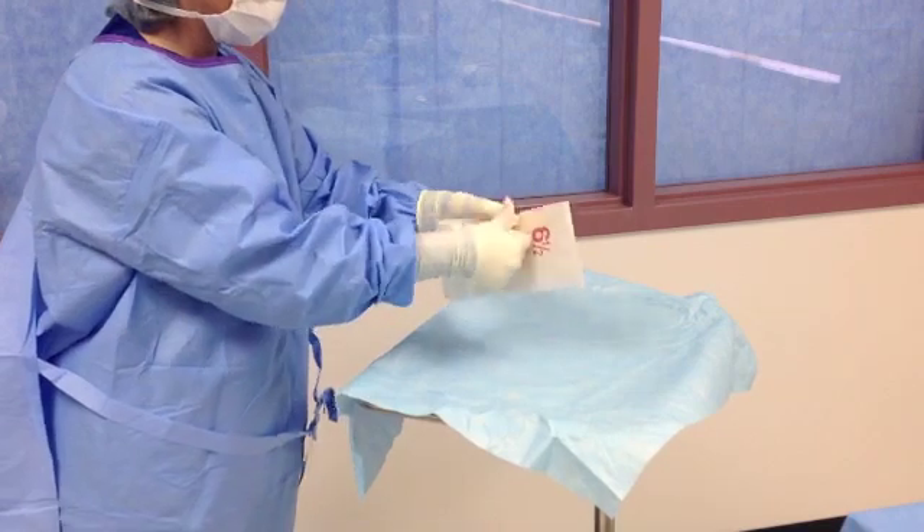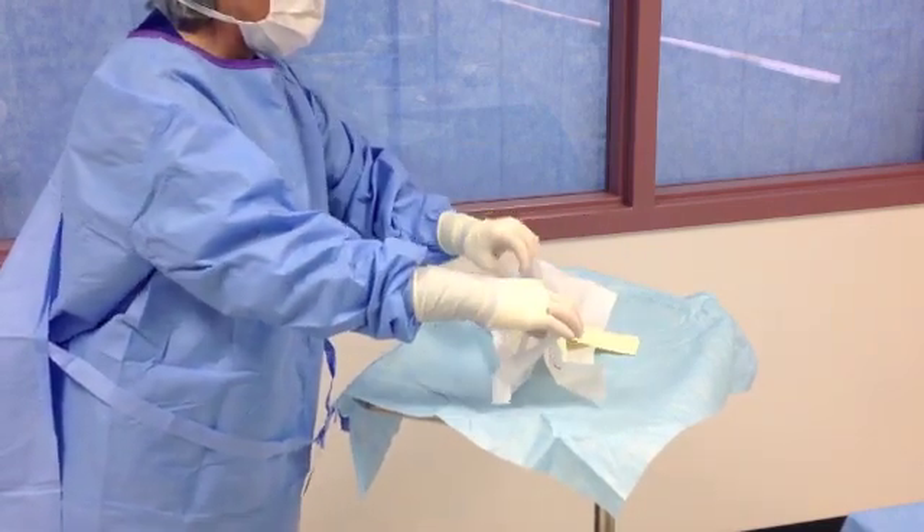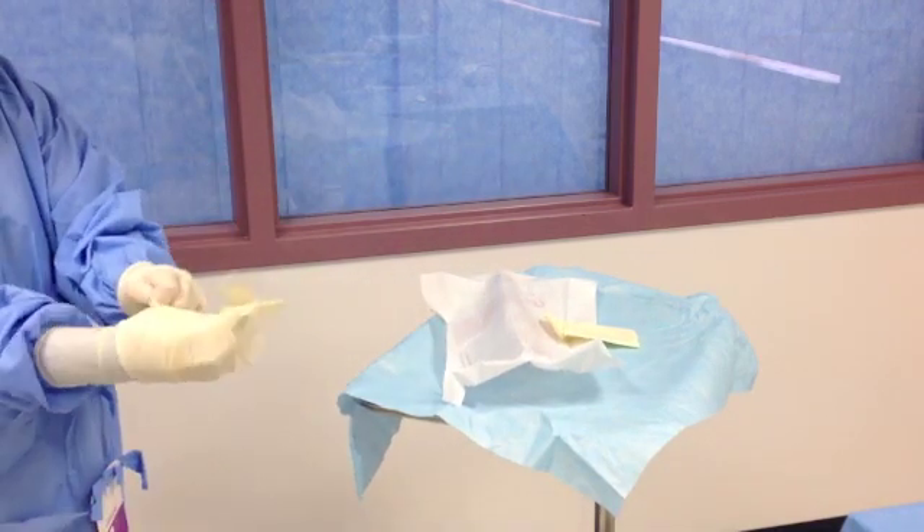To double glove, pick up the first glove at the cuff edge and advance your fingers into the glove. Repeat this process for the second hand.